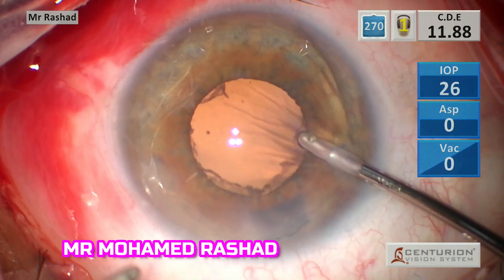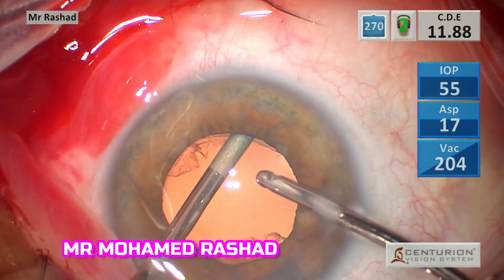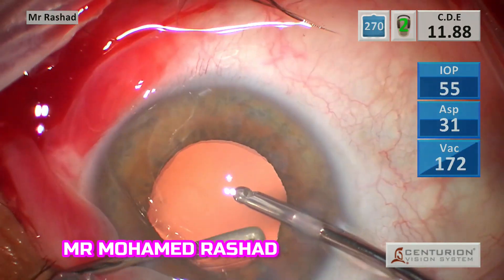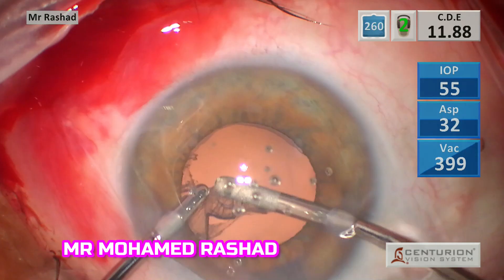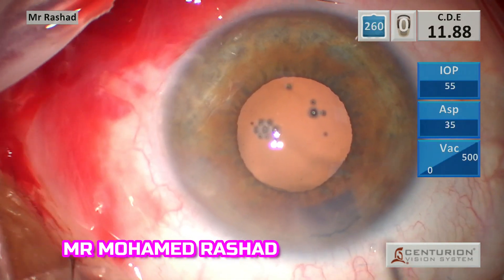I prefer using bimanual irrigation-aspiration. This helps me to get the sub-incisional cortex easily, and in cases of small pupil it helps to avoid injury of the iris.